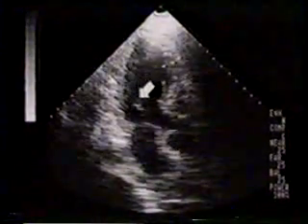Perhaps you noticed the head of the ruptured posteromedial papillary muscle. It is in better focus on this apical long axis view. This is the base of the muscle. The head of the muscle has completely separated from the base. In real time, the head will flail back and forth during the cardiac cycle.